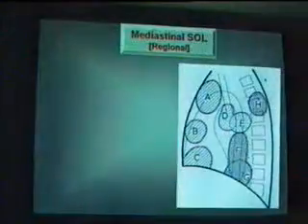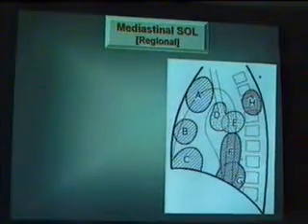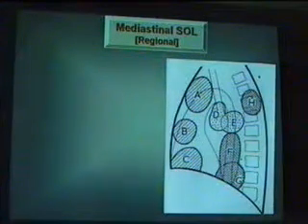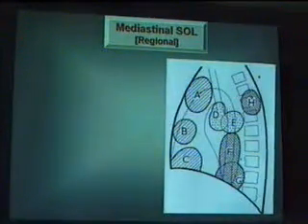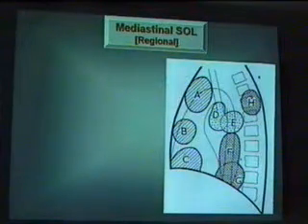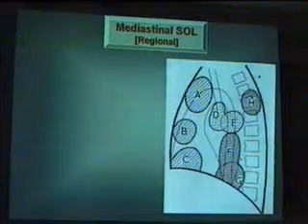طيب لما نيجي نتكلم على السبيس اوكيوباينج ليجنز او ليجنز اوف mediastinum هناك طريقتين لللوكاليزيشن او للكلام على these lesions. either ان نقسمهم regional او نقسمهم according to the tissues اللي طالعين من adipose tissue، طالعين من nervous tissue، طالعين من vascular tissue and so on. اوكي؟ طبعا افضل شيء ان احنا نحط الاثنين مع بعض الريجنال والسايت اوف اوريجين. لما نحطهم مع بعض يقوم الديفرنشال دايجنوزز يقل شويه واقدر اطلع الموست بروبر دايجنوزز.